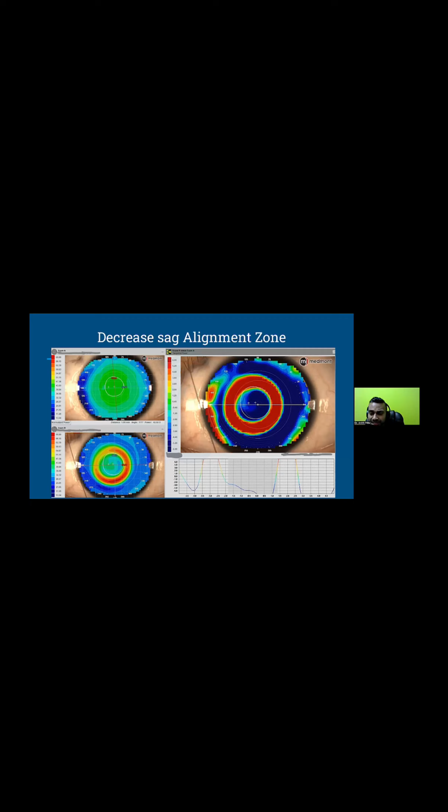And what I'm depicting here is a tangential power difference map. That's what I would recommend for evaluating the shape and alignment issues. I look through a lot of different topographies when patients come in and when I do a design. But for an Ortho-k follow-up, what I'll look at initially is a tangential power difference map. So I'll select the baseline, select the topography from that day, and look at the difference. And that's what's depicted here on this right image. This shows me how well centered it is. It shows me what kind of impact I'm having on the myopic defocus portion of it, the peripheral plus of this red ring. So that really shows me the shape factor issues. Now, I'll also switch to the axial difference map to show how much of a refractive error correction I got. And if your topography allows, a refractive difference map also will show that.